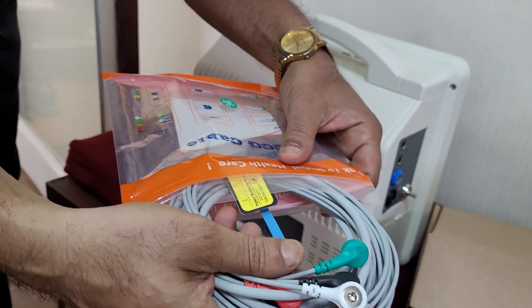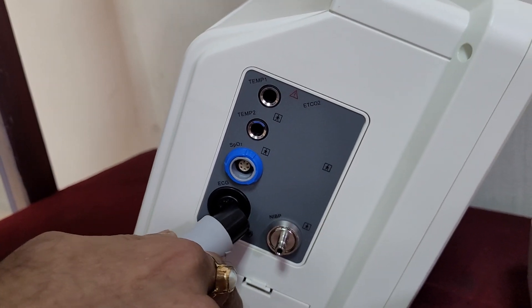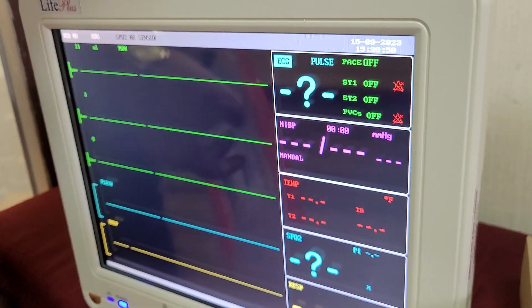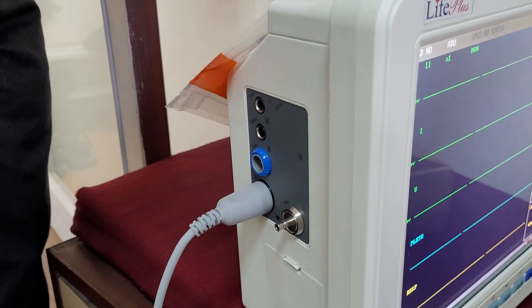This is an ECG cable, which is connected over there — ECG. It's a 5-lead ECG machine and needs to be connected in that side, here. How do you connect? You connect it to that point. This is the connection.